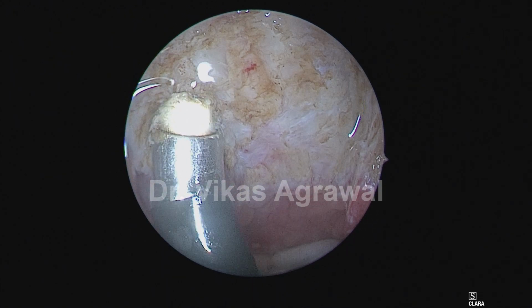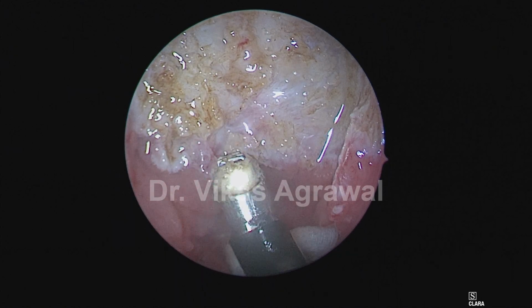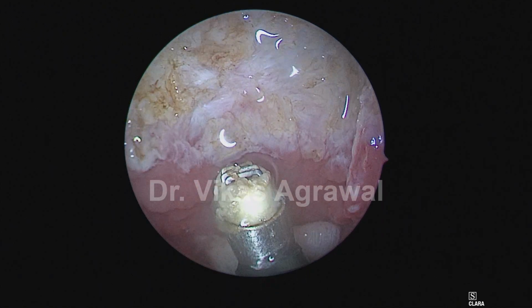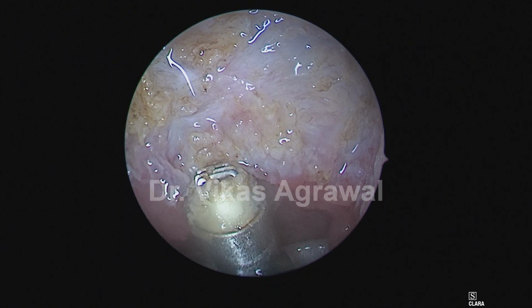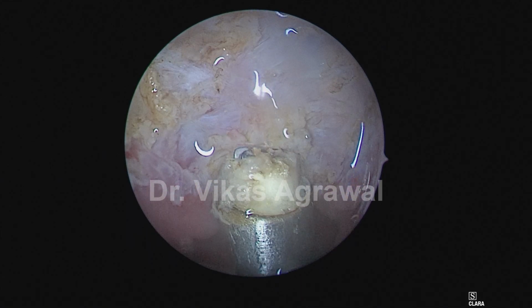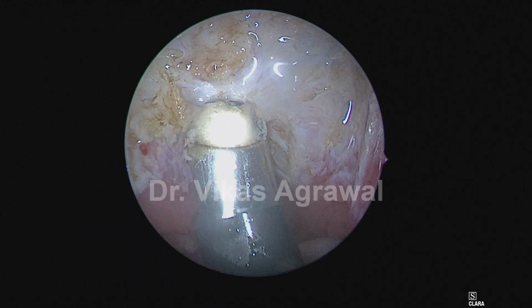Now that we have completely performed the adenoid removal on the left hand side, that's the buccopharyngeal fascia. So obviously we have not opened up the fascia. That's the level of the Passavant's ridge. I'll remove completely, but I'll not open up the fascia.